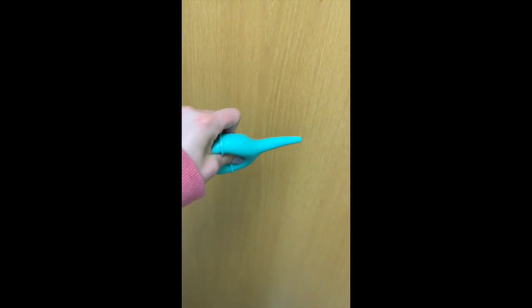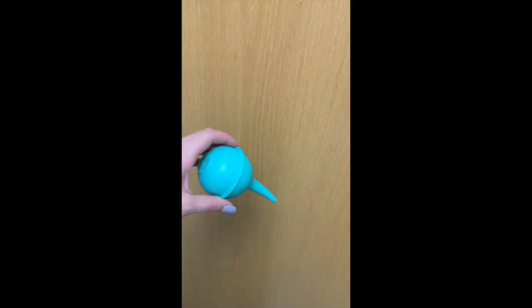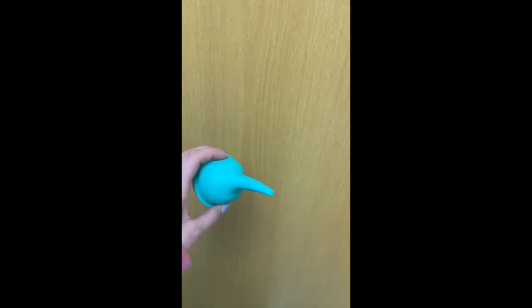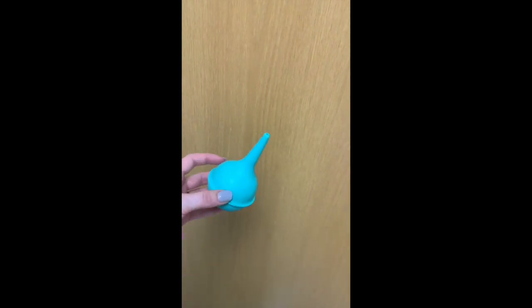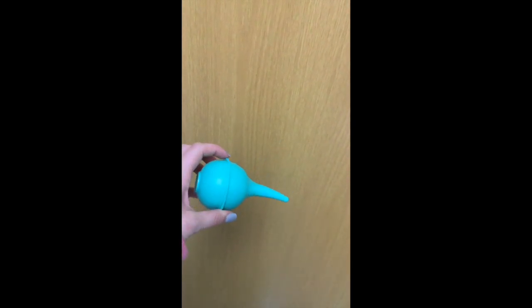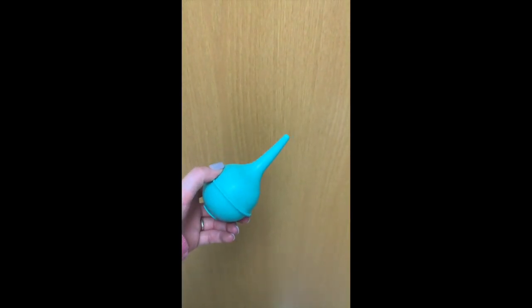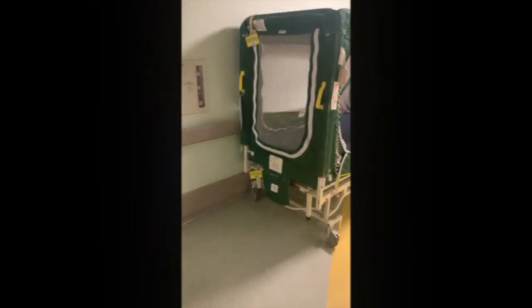So you squeeze, and then you insert it, release, to then suction. It can be very gentle, it's very easy to control. Like I said, it's especially great for our super small kiddos, or if you just need to get up into the nostrils or the inside of the mouth, not anything super deep. An added bonus is that it's also portable. Yeah, it's a great little tool.